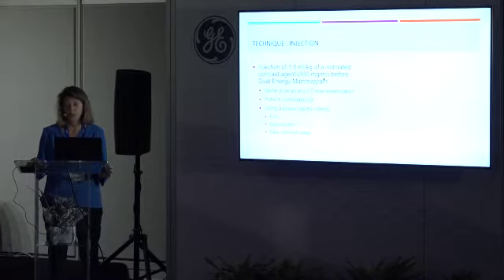Usually we perfuse the patient in the arm, and the breast is not compressed when we inject. That's very important. We inject while the patient is seated or lying on the bed, usually the ultrasound bed, which is near the mammography room or inside the mammography room if you have the possibility. It's better and more reproducible to use a power injector with a high bolus, exactly as we do on CT. It's really fast and reproducible, and we rinse with saline, of course. Side effects are the same as with iodine, not very important. Of course, allergy is a contraindication, but it's not so common.